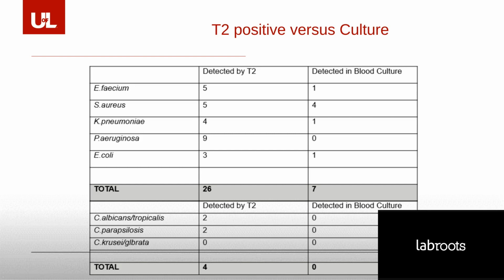But once again, the Candida and so forth, as you can see here, the different species, we did pick up through sensitivity on the T2 the Candida albicans, tropicalis and parapsilosis. Matter of fact, we had a parapsilosis just before we went live this morning, and bone marrow called me and said, should we believe this? And I said, of course, and the patient is now on the appropriate targeted therapy. So that gives you an example of the influence and impact that the laboratory can have on patient management.